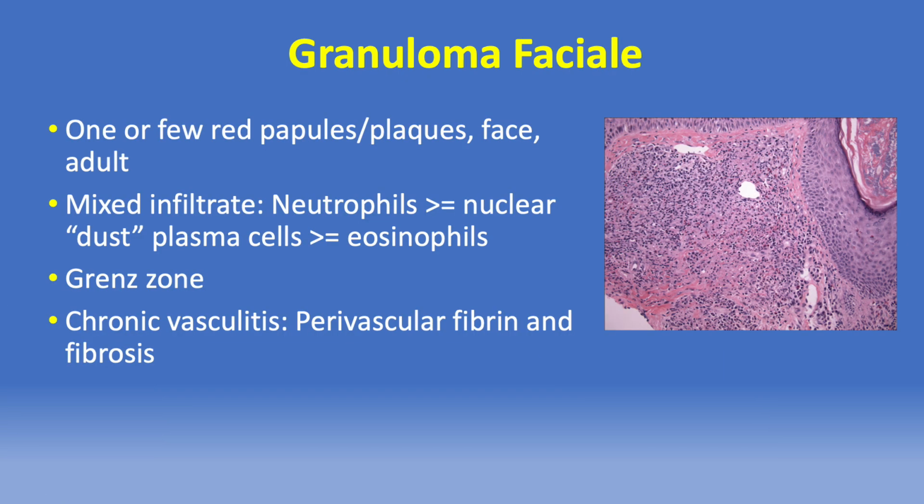Granuloma faciale, characterized by usually a solitary erythematous papule or plaque on the face of an adult. Histologically quite distinctive, with a relatively dense mixed infiltrate that, despite its density, characteristically spares the immediate subepithelial zone, forming a Grenz zone, and classified pathogenetically as a chronic form of LCV.